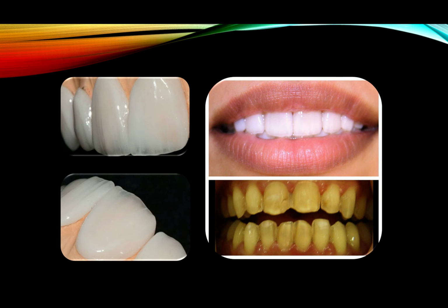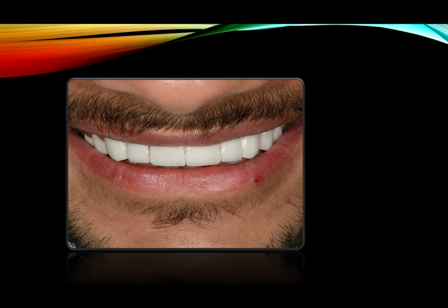Now, I don't call that layering. Mostly I can call it microlayering. That's what I call it. I call my work microlayering or monolayered, monolayered prosthesis or micro-layered prosthesis. Now, let me show you more examples.